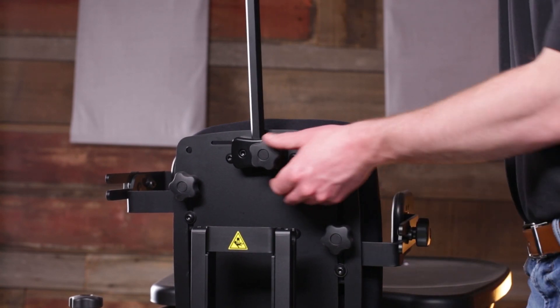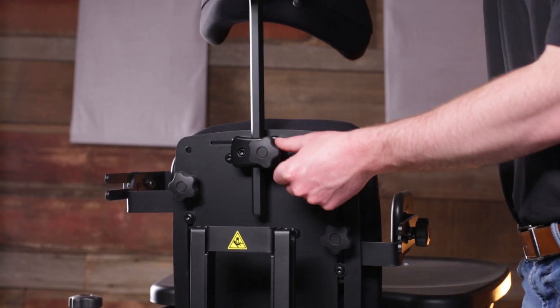Use our adjustable headrest or mount a third-party headrest on our universal mounting bracket.